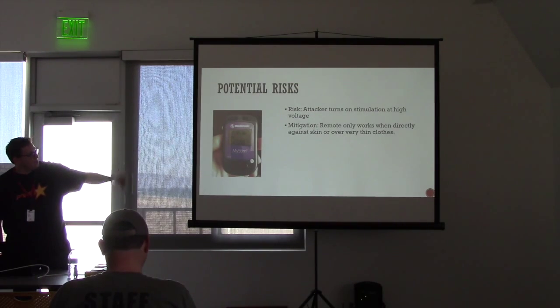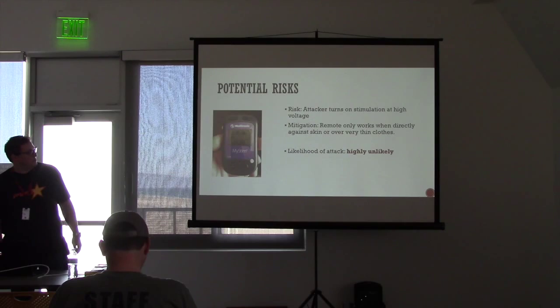So the remote only works when directly against the skin. Same idea as a clinician programmer. Very unlikely that there would be an attack.